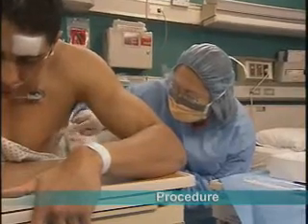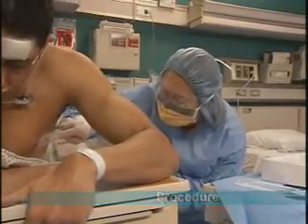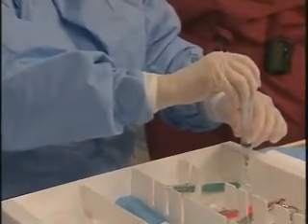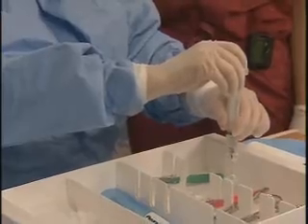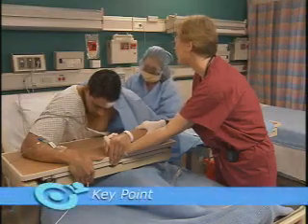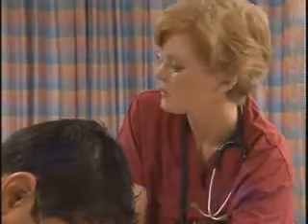Next, assist with the procedure. Expect the physician to apply antiseptic to the insertion site. Then expect her to inject a local anesthetic, such as lidocaine, to numb the area. While the physician inserts the chest tube, reassure the patient and assess his pain level. Administer another dose of analgesic if indicated and prescribed.